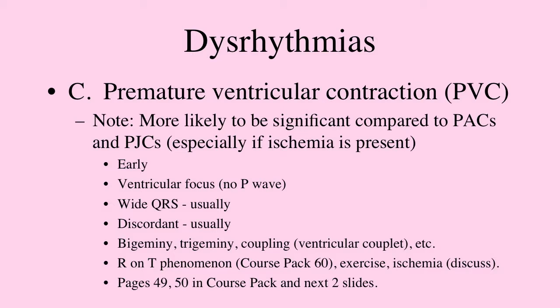In this case they look a little different from each other, and you have in one case a ventricular couplet too. If they look a little different, they can be called multiform PVCs, or sometimes the word multifocal PVCs is used. If they all look the same, they're called uniform or unifocal PVCs.